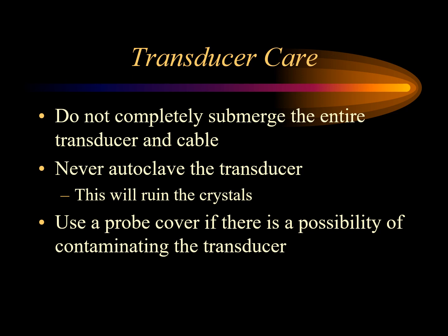And if there's ever a possibility of contaminating the transducer, you'll want to make sure you use a probe cover. So for any intracavitary type of exams, if a patient has an open wound or sore, you'll want to make sure that you use a probe cover so that you're not getting the probe contaminated. If you're ever questioning, it never hurts just to throw a probe cover on the transducer to be safe.